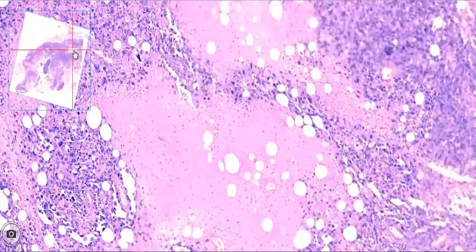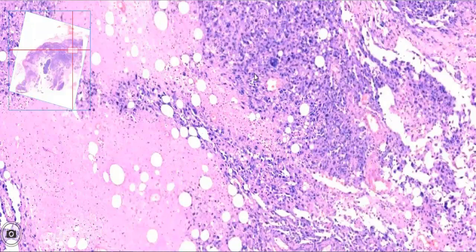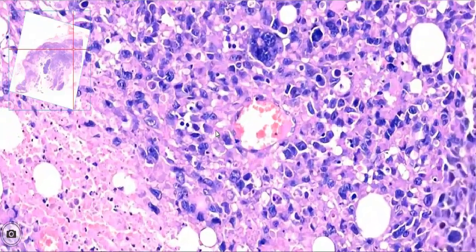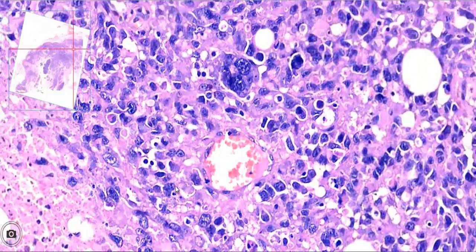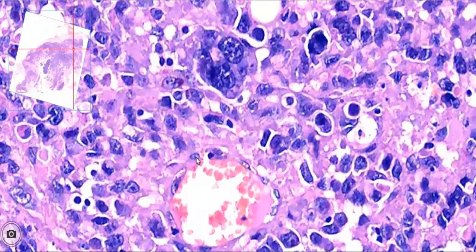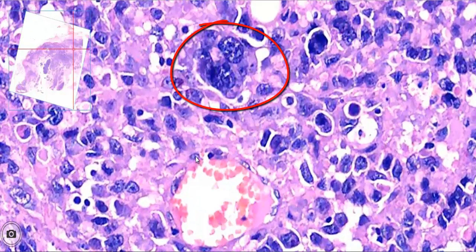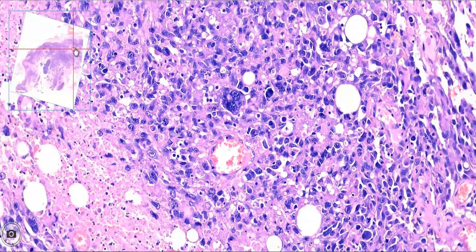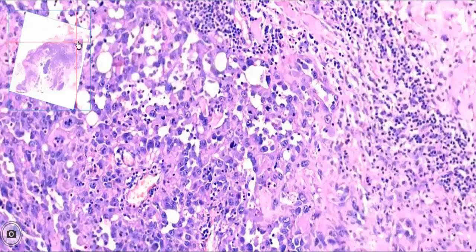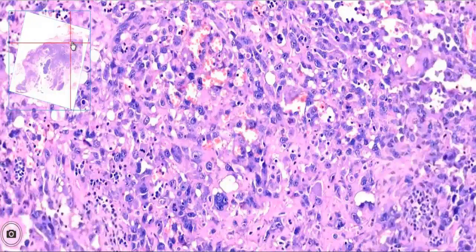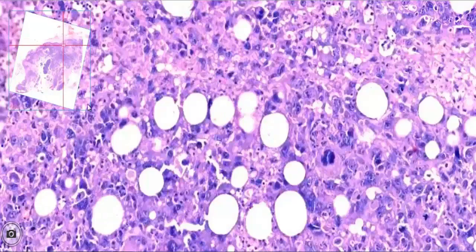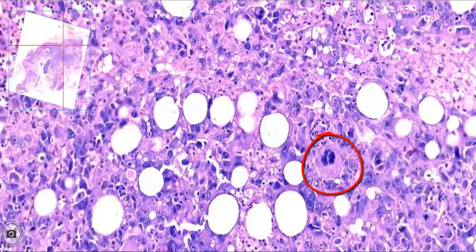Another area nearby shows a bizarre tumor giant cell with multiple nuclei. On panning the slide around, we find undifferentiated tumor cells with high mitotic activity and abnormal mitotic figures. One such abnormal mitotic figure is present in this field.